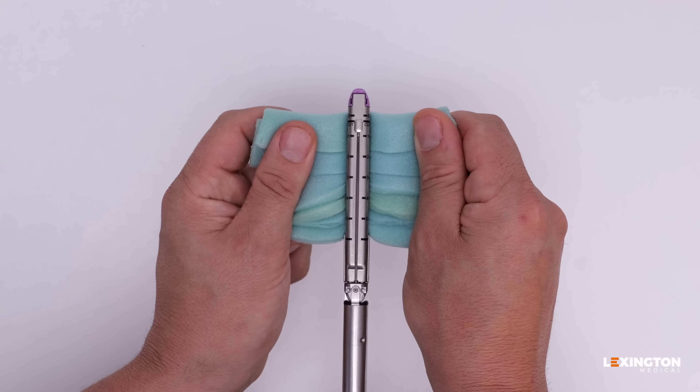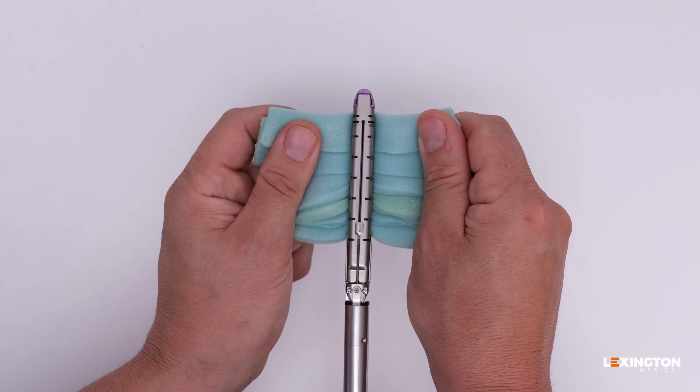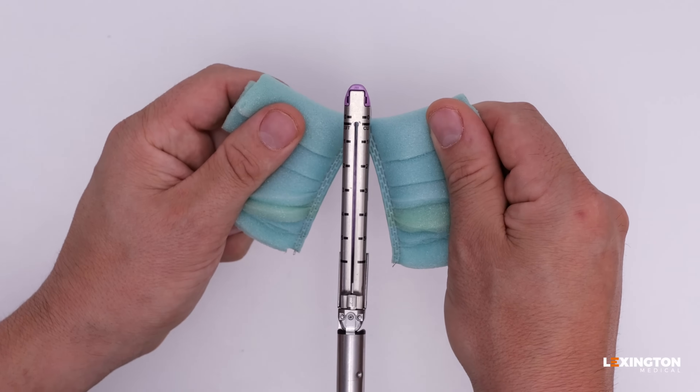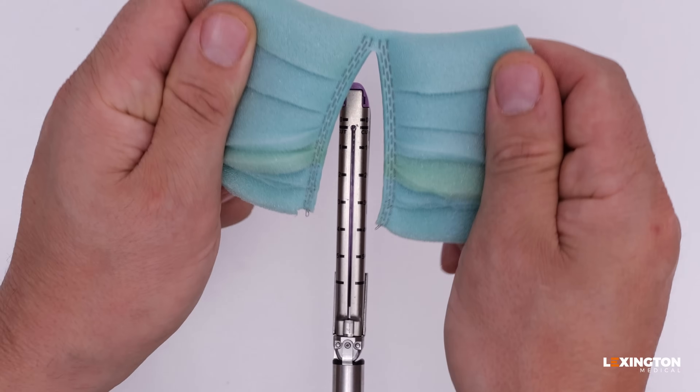These excellent quality staple lines are achieved through a combination of smooth firing, a new knife blade in every reload, and three staples that are the correct height for the specific tissue type.